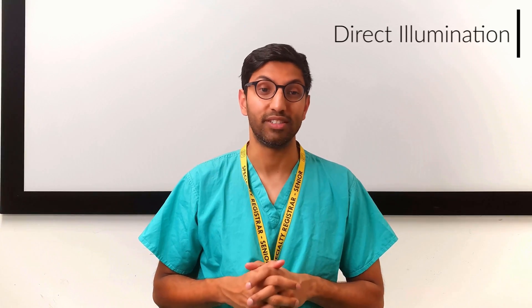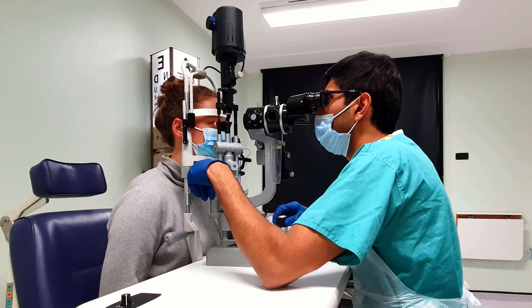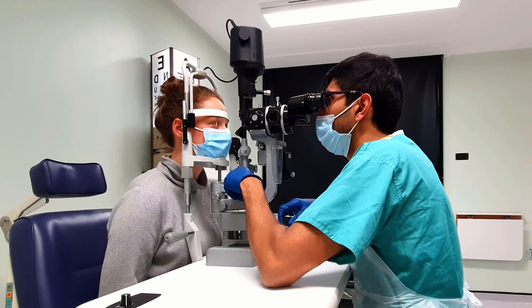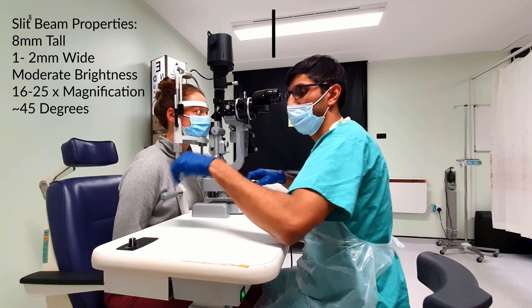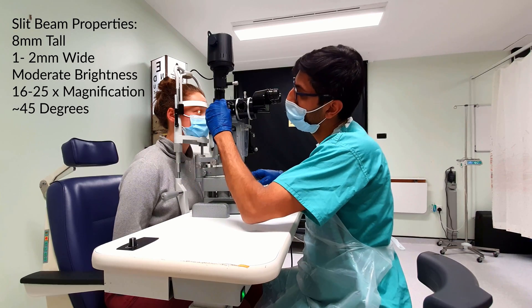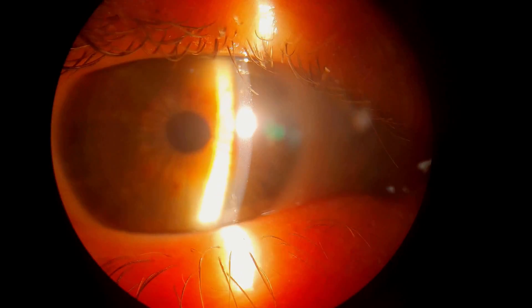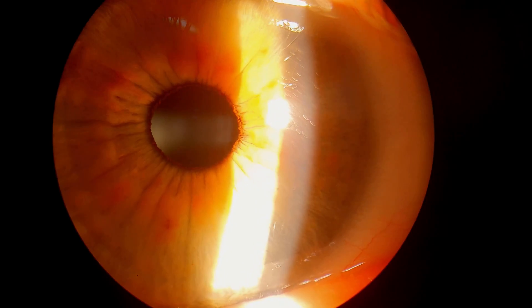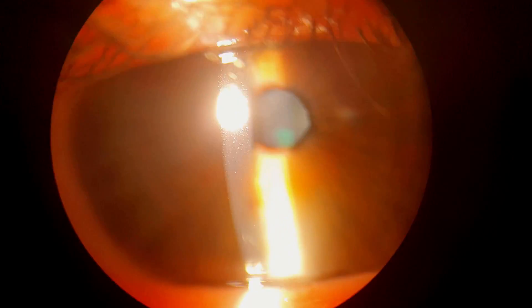Next is direct illumination. Direct illumination involves your microscope being focused directly on the slit beam. There are different ways to use direct illumination depending on how wide the slit beam is. For the moderate width, use a tall slit beam which is about 1-2mm wide and moderately bright. You can go up to 25 times magnification if required. This gives you a moderate slit beam which can be used to directly view structures with high contrast.